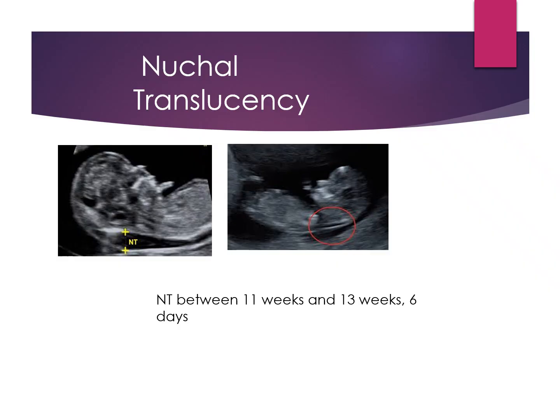And then nuchal translucency. If you guys remember way back when we first started this, I said that it kind of hangs out in the first trimester, end of the first trimester, beginning of the second trimester. So the nuchal translucency is a very specific test, and you actually have to have a certification to do it.